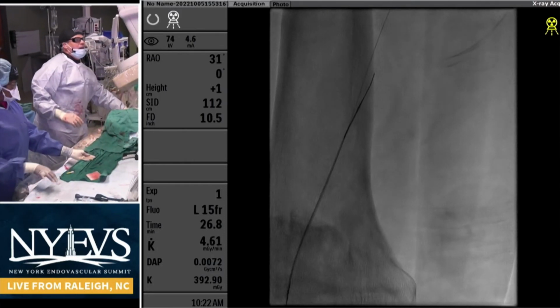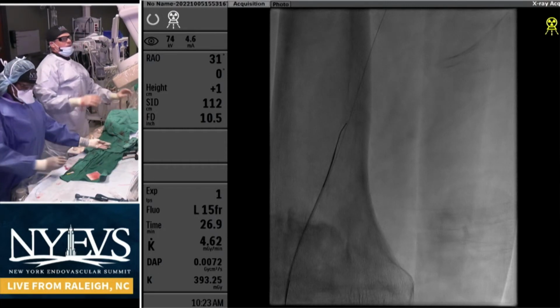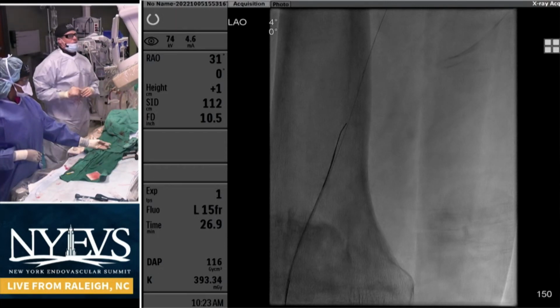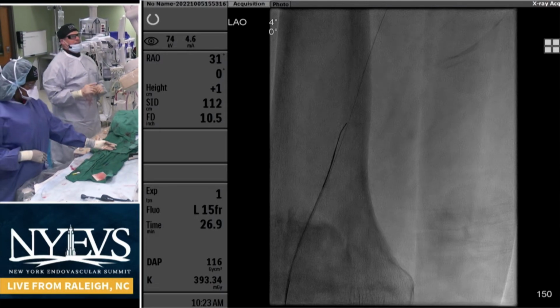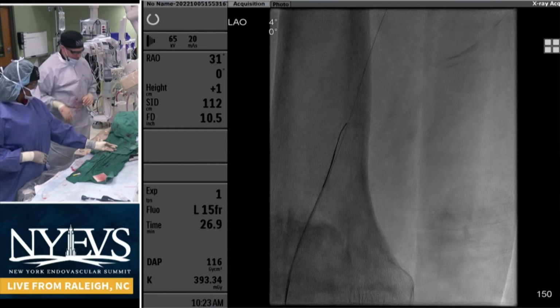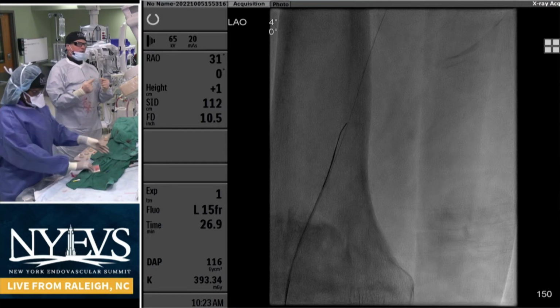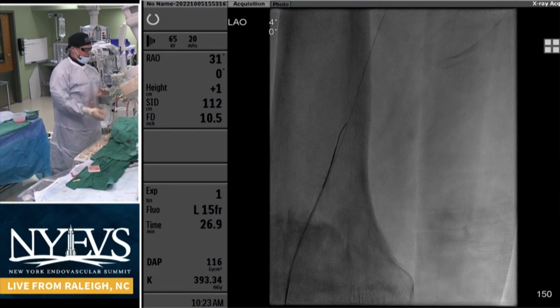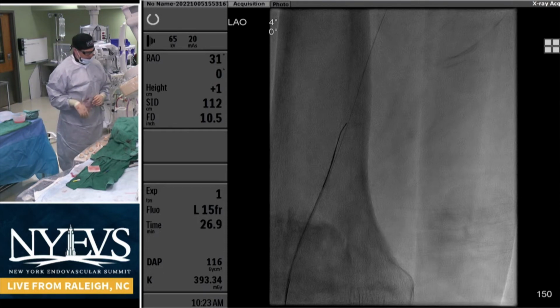So what I'm trying to do is I'm trying to get an angled Dave catheter down to that level, and I'm going to externalize the wire. But I may have to take a balloon before I do that because what's happening is my Dave isn't long enough. So I'm trying to get it down there, but having a little difficulty. But once I get the wire close to the catheter, I'll externalize it. And then once I externalize it, I'll be flossing and I'll be able to open this whole thing up and we'll get a better look. So if you want to go to your next talk.